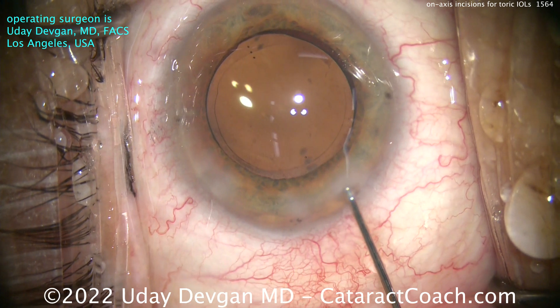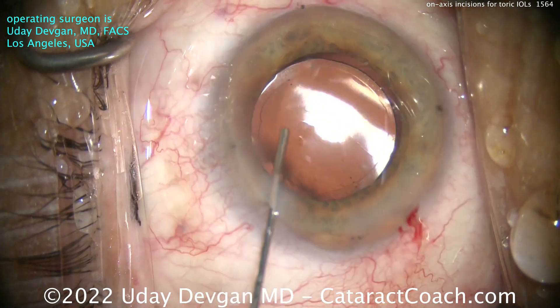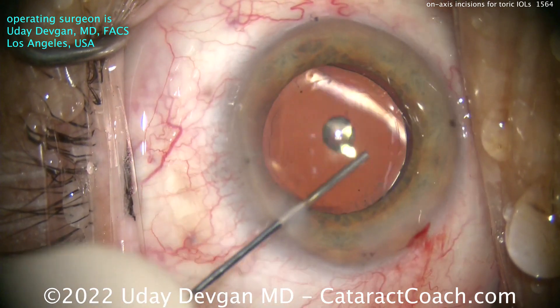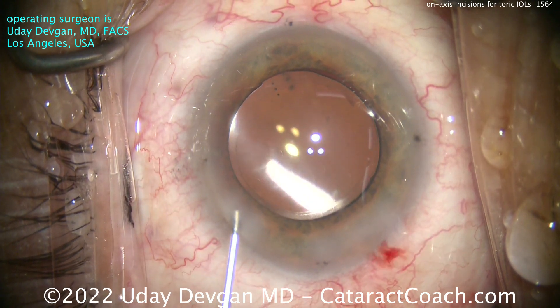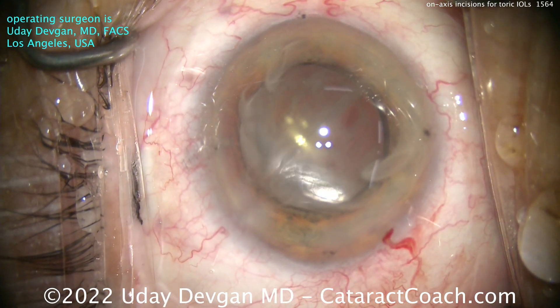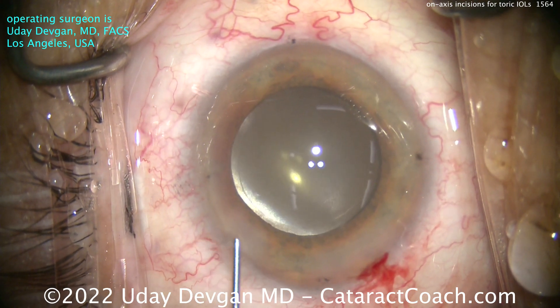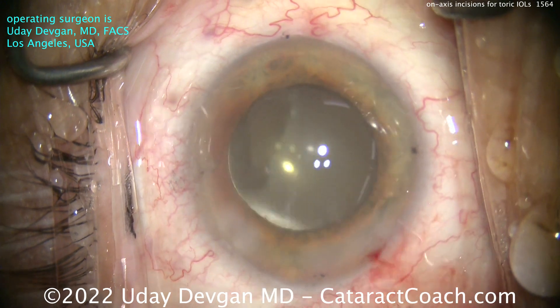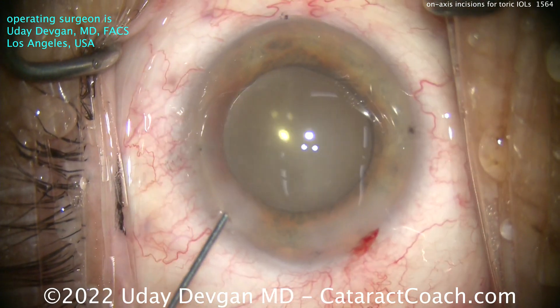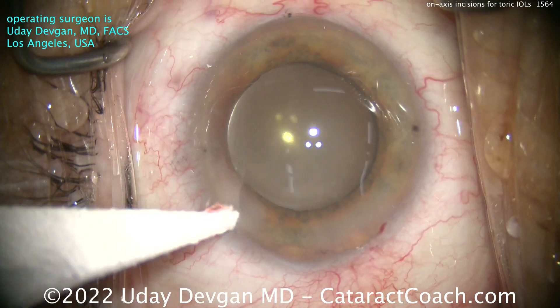Now I'll seal up the incision. You can see the toric marks on the IOL are going to line up beautifully with the toric marks on the cornea. I'll get those Purkinje images lined up and make any small adjustments needed. Yes, you can use intraoperative guidance systems costing hundreds of thousands of dollars — we have all of them at our Beverly Hills surgery center — but Cataract Coach viewers are from around the world and want a simple way to achieve a beautiful, accurate result, which I've just shown you. Here's the end of the case — a beautiful outcome. This patient achieved exactly what we wanted and was absolutely thrilled. There's a whole toric IOL section on cataractcoach.com you should check out if you have a keen interest in giving the best to your patients.